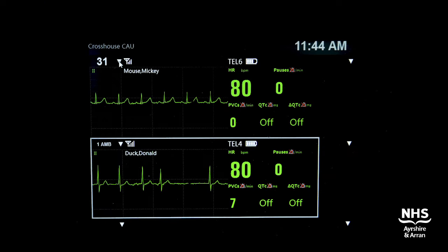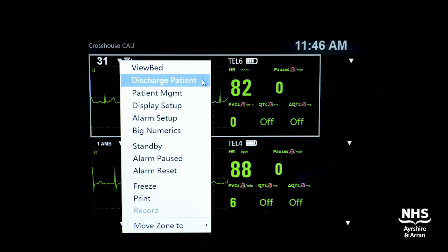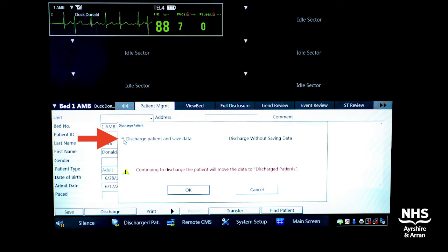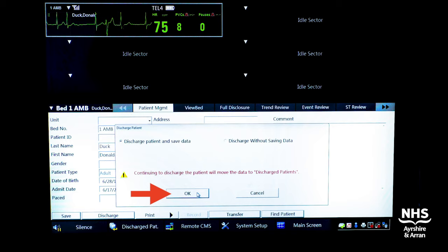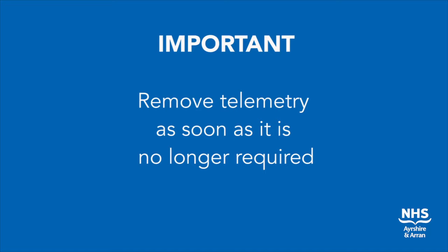To discharge a patient, again start by clicking on the triangle at the top left of their screen. Then click discharge patient. Click to save data, then finish this process by clicking OK. We ask that all doctors reviewing patients on CAU be mindful that telemetry is removed as soon as it is no longer required.